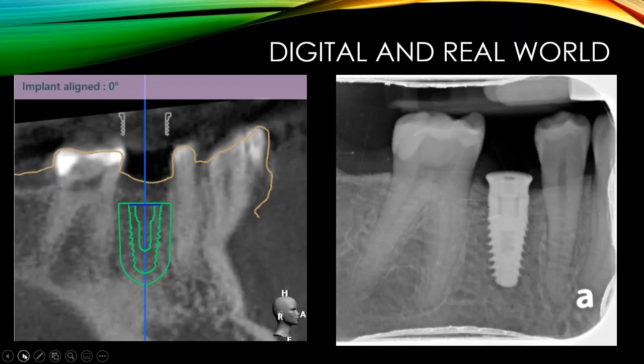And it's pretty amazing because, again, the level of precision makes this such that a surgery day is not a stressful situation. You can feel very comfortable that with the right planning, with the right data, you're going to get that implant in an ideal position. To do this freehand, again, it's possible, but there is a good deal more stress involved in achieving that.